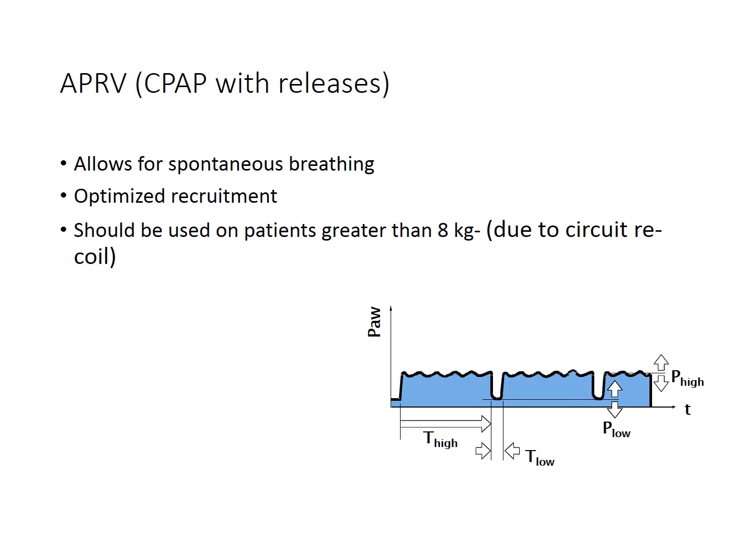So APRV is CPAP with releases. Again, we're allowing for spontaneous breathing, optimizing our recruitment, and it should really only be used on patients greater than 8 kilos.